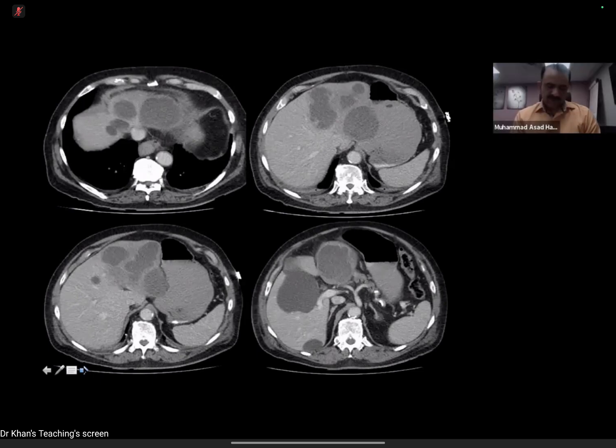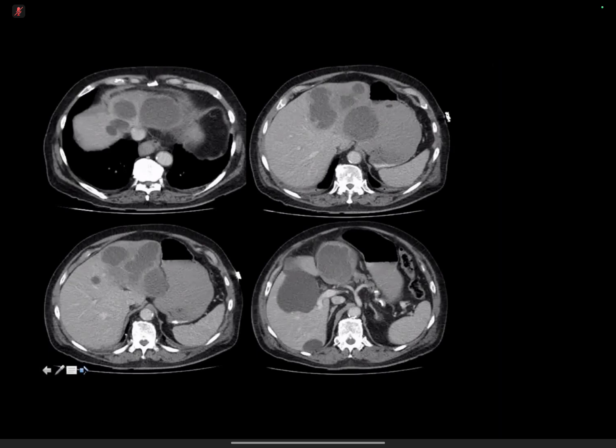Good. You described it very well. It's basically the buzzwords which the examiners would like to listen to, that you are going to use Seldinger technique, because what is exactly meant by Seldinger technique? Do you know? So that technique would essentially indicate the placing of a guide wire to the target position prior to the placing of the final device, in this case the drain, over that guide wire. Good.